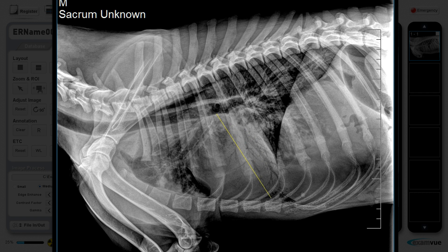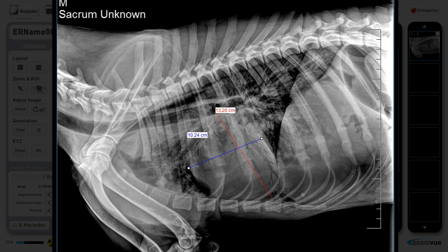Draw a line and measure the longest axis of the cardiac silhouette from the carina of the mainstream bronchus to the apex. Draw the second line to measure the short axis at the widest part of the cardiac silhouette, perpendicular to the long axis measurement.